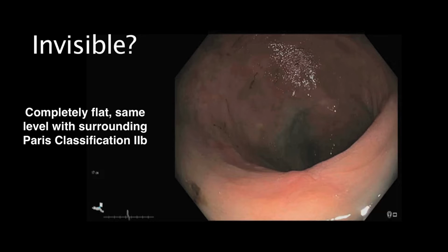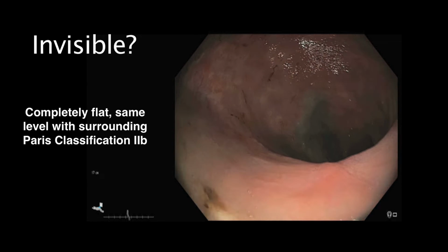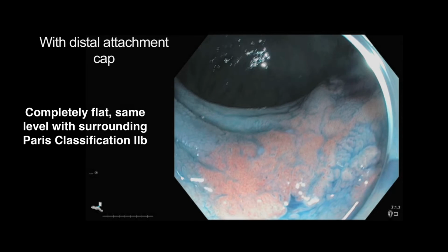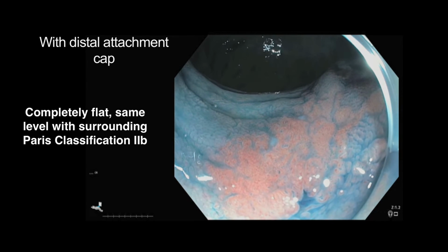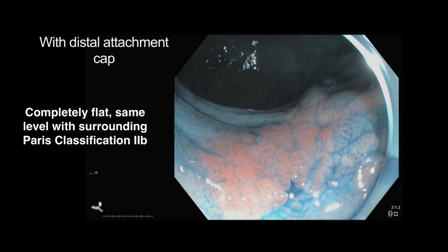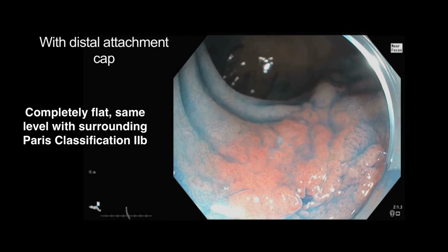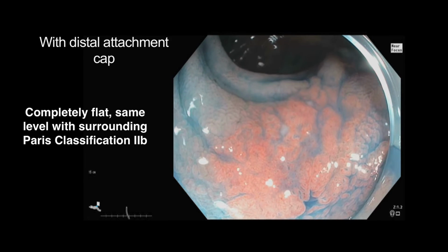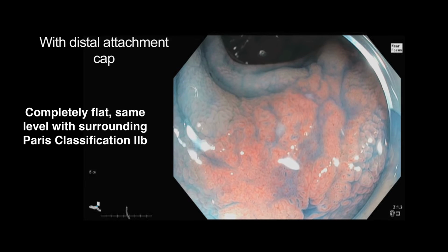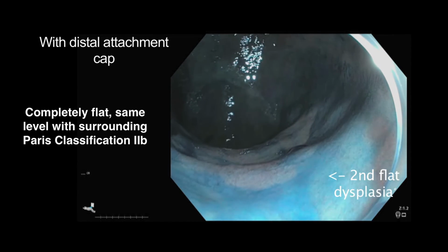Using older generation colonoscope models, we could imagine that a subtle lesion such as this could have been deemed invisible and missed. Using new models with high definition and improved technologies, the slight erythema and mucosal deformity could be seen. Further detailed inspection using indigo carmine chromoendoscopy delineates the borders of the flat lesion, revealing it to be much larger than appreciated with white light.